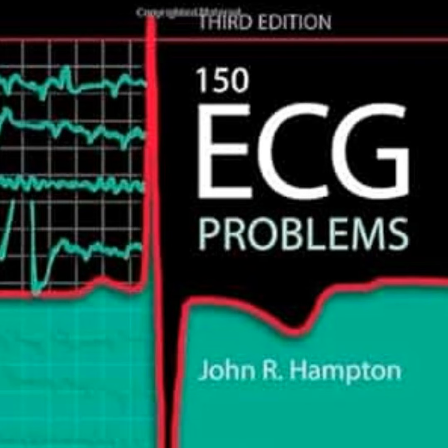Oh, this is a great case. Hampton presents this patient with atrial fibrillation who suddenly develops frequent ventricular extrasystoles. Now, on the surface, it just looks like the cardiac tissue is becoming irritable, right? Right. But the actual diagnosis requires looking at the patient's medication list and their metabolic panel. It's a case of digitalis toxicity exacerbated by hypokalemia.